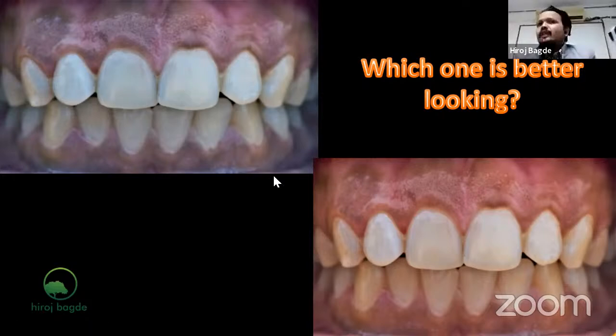So a big difference. It is all yellowish here. We can see melanin pigmentation, and we can see the white halo. So we have a good image with good exposure and post processing. We need to process each and every image.